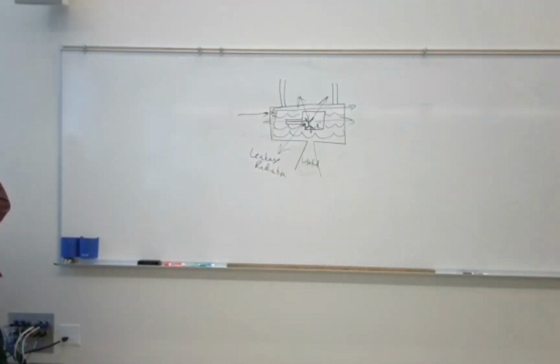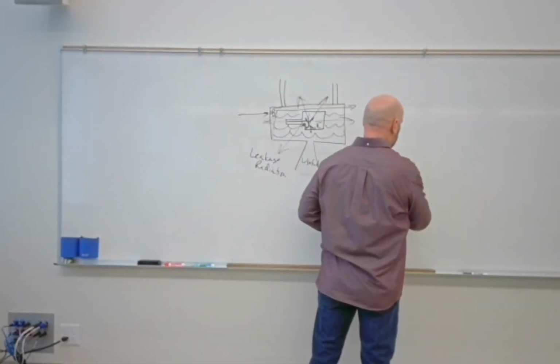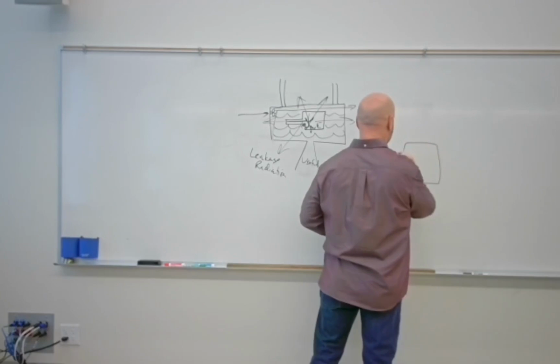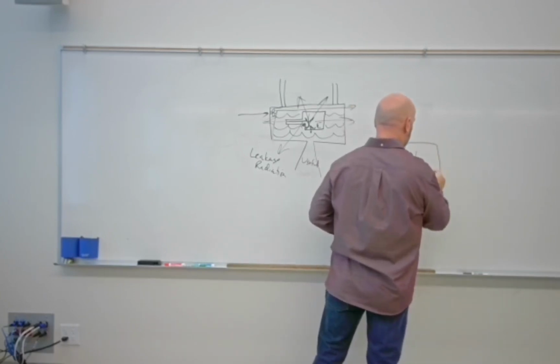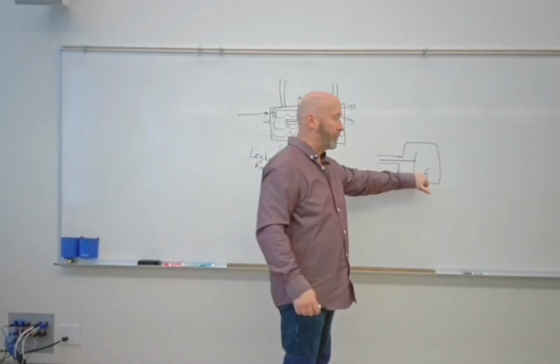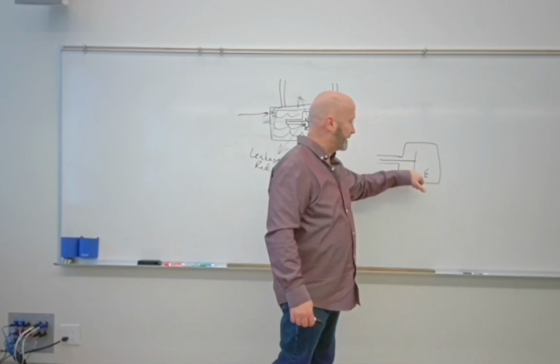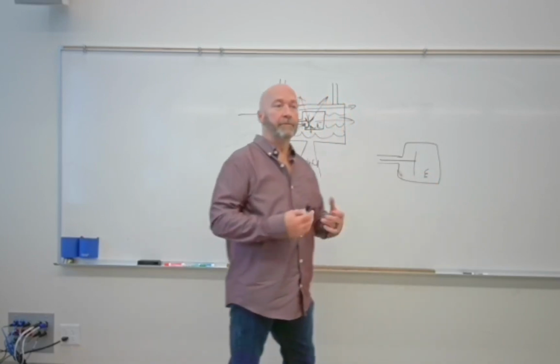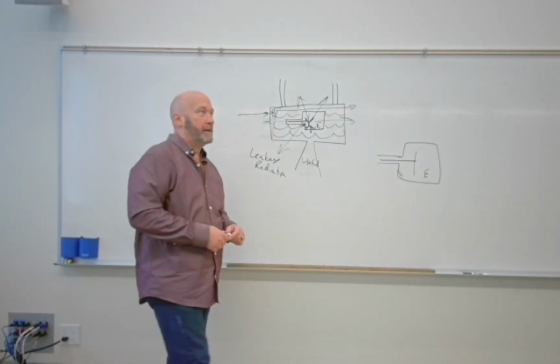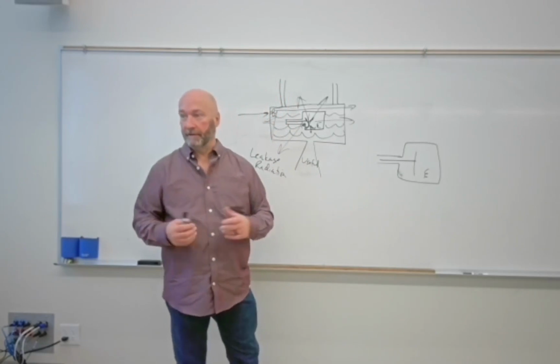When we make exposures over time, and I think we've talked about this, we've got an X-ray tube, right? We've got the anode and we've got the cathode. But over time, the more we use our X-ray tube, the more this thing is going to melt. This is made of tungsten. This is also made of tungsten, and this is made of tungsten as well, for a couple of different reasons. One is that it has a very high melting point, about 3,400 degrees Celsius before it melts, but it does melt eventually.